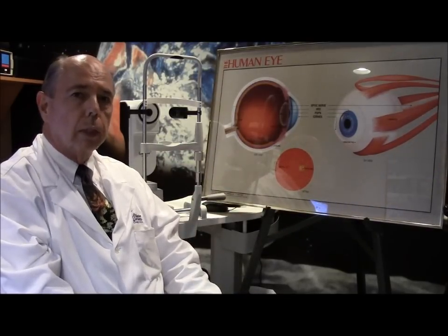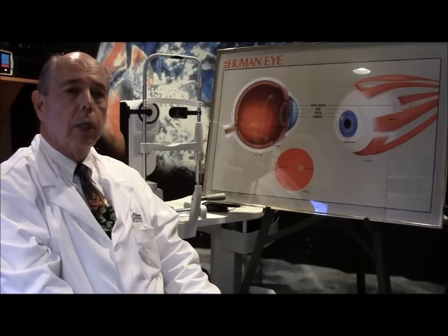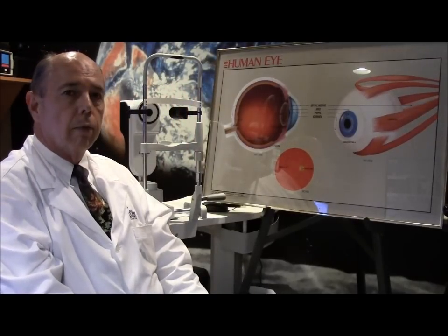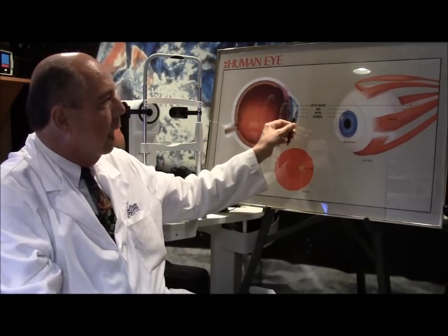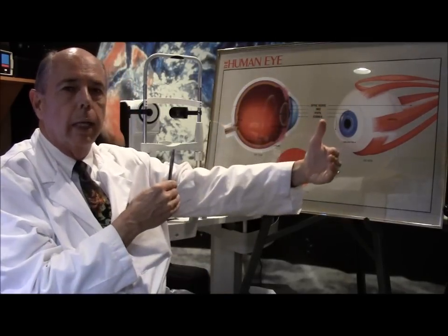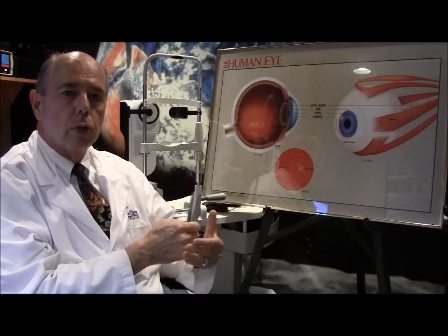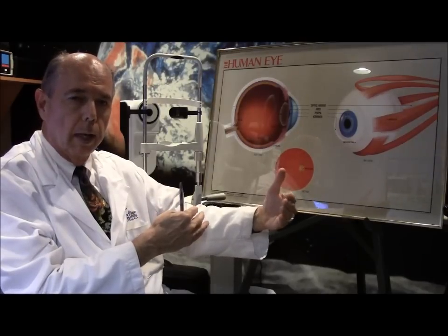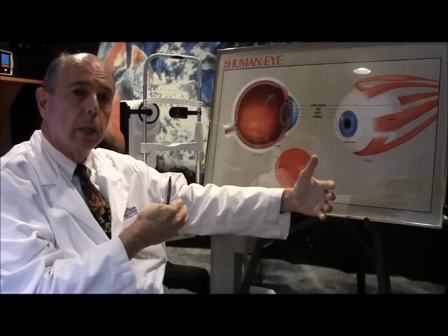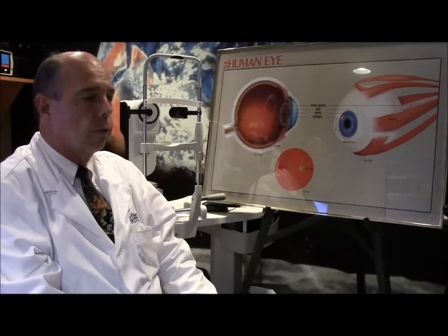What are we measuring? It's purely optics. One of the machines we use is called a LensStar, which is fantastic and very accurate. What we're doing is measuring the distance from the cornea back to your retina. That actual length is extremely important in knowing whether your eye is nearsighted or farsighted. A farsighted person typically has a shorter than normal eye, and a nearsighted person has a longer than normal eye. So the length of the eye determines whether you're nearsighted or farsighted.